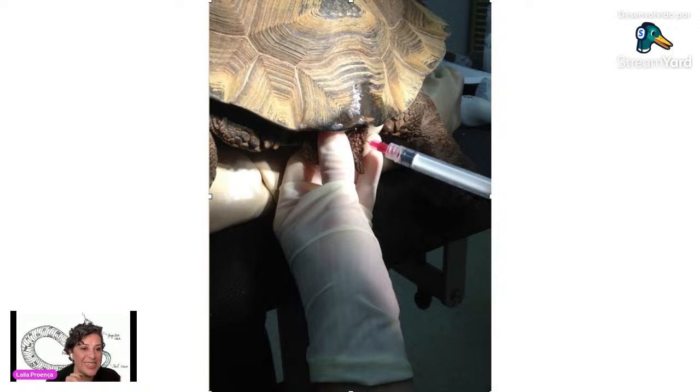This is collecting from the tail vein. Again, scrub a lot if you're going to collect from this place. I usually only use it if I need to. I rarely use it, seriously, because the thought of introducing bacteria in that vein there, because there's always poop and urine there. As much as we scrub, there's always a little bit. I usually don't use it. But if I really need to use it and can't collect from anywhere else, I might collect it for biochemistry. Okay.